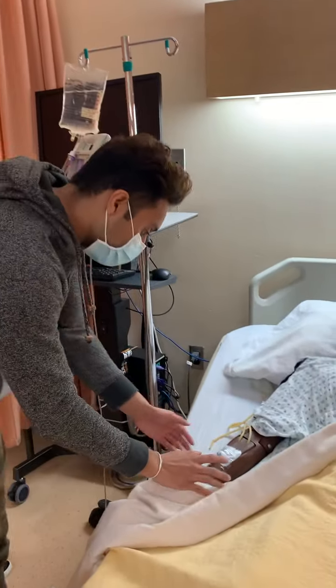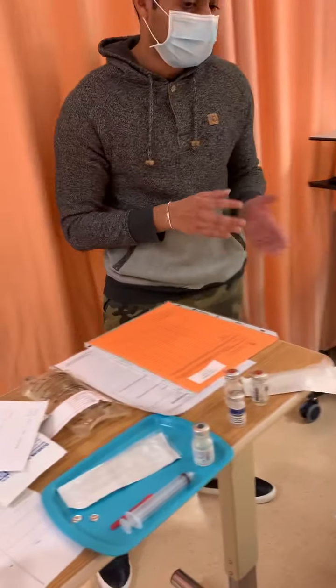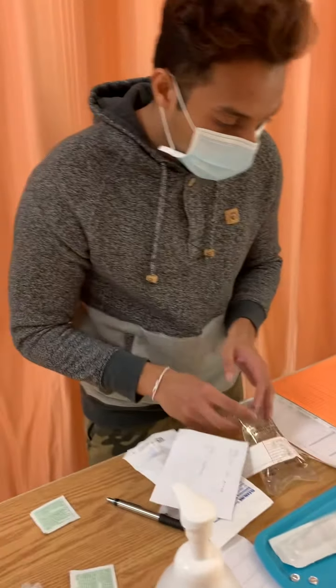And we see you're checking the patient's IV site, and we see that there's no swelling or anything, no infiltration, IV site's all good. Experiencing pain at the site? No, the patient denied pain, so we're just going to wash our hands. And we're going to do our third check.